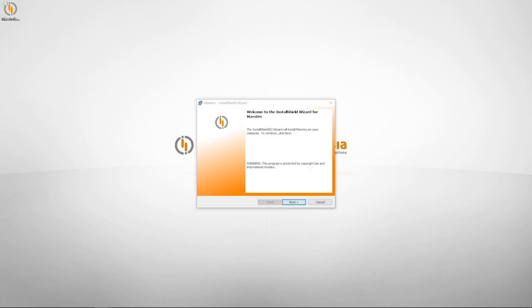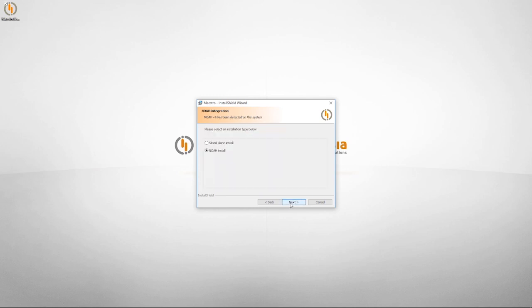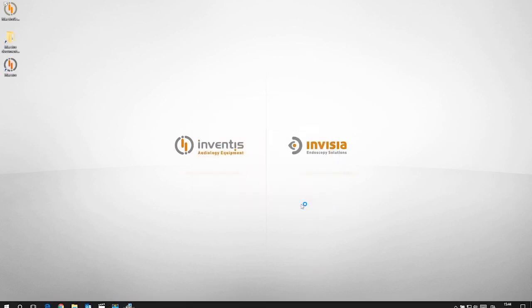Double click on the installer to run the application, confirm all the settings and then press install. Once installation has finished, connect the Clarinet and start Maestro by double-clicking on the icon.